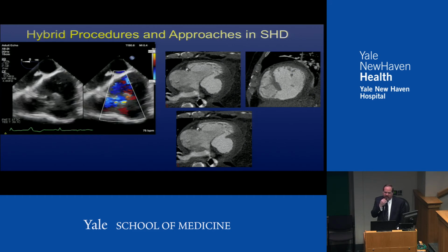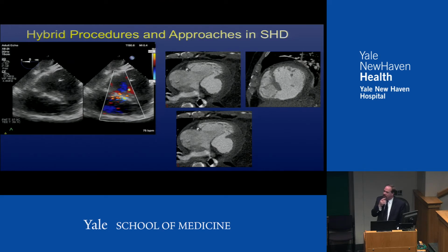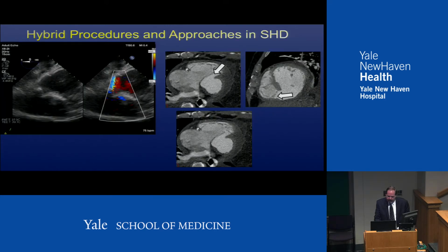So this is unfortunately an ischemic VSD in a patient that had an inferior posterior septal VSD shown in the upper image. It's interesting. And you can see the CT images on there. You can see a 4-chamber view on top, and then you see the sort of aneurysmal chamber with the VSD moving toward the apex. So what's the problem with this? How would you do a percutaneous approach?